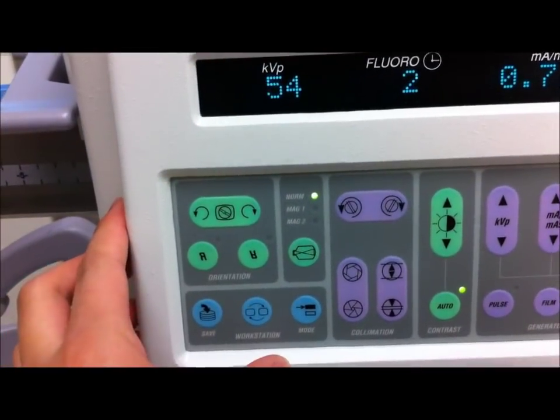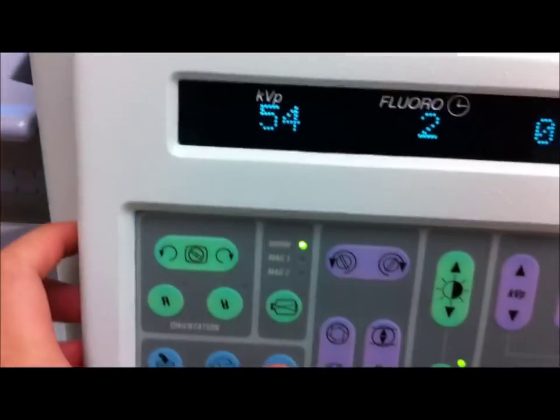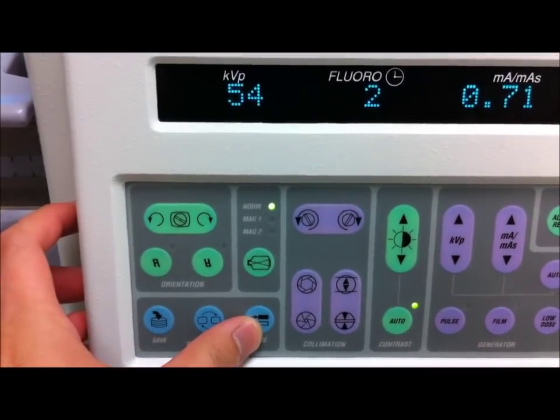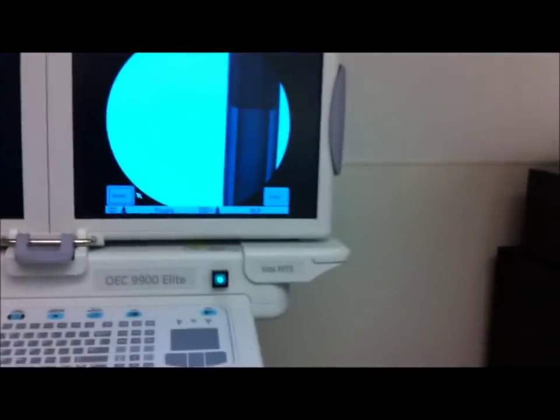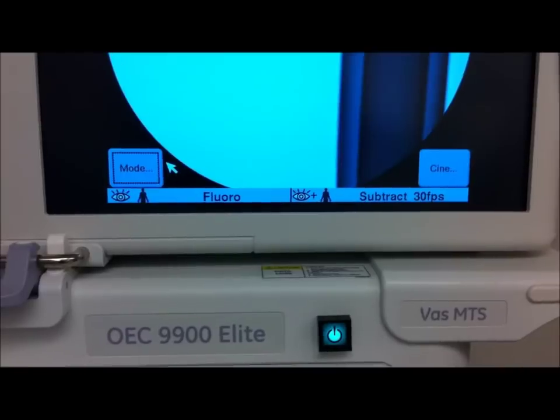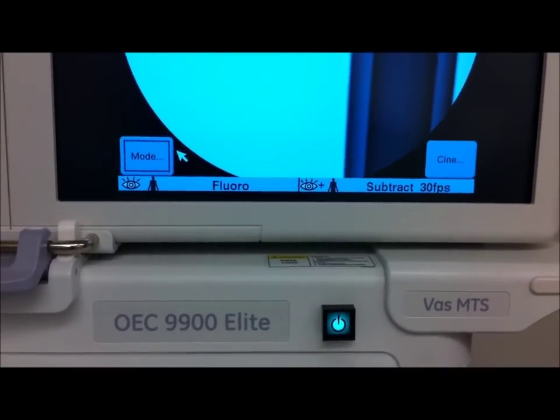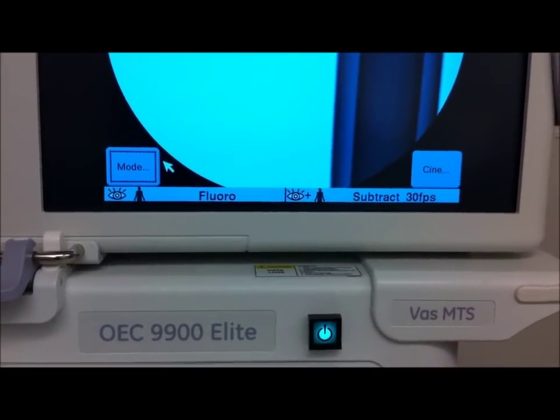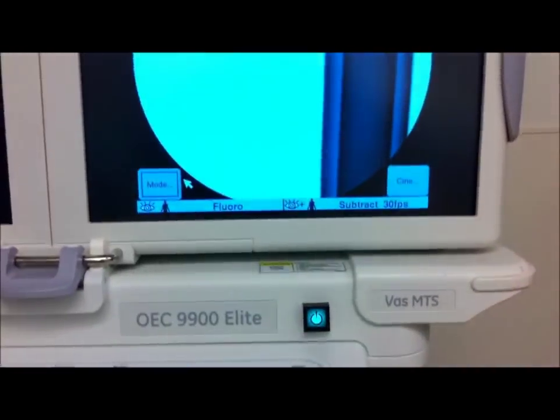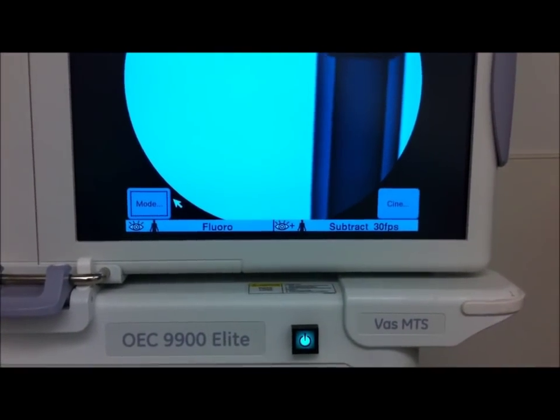This one is called mode. It has a special application because this is an interventional C-arm equipped with an interventional package. If I press this — looking at the bottom here — it puts it into subtraction mode. If I press the high-level fluoro button on the foot pedal or on my hand remote, which I'll show you later, this will put it into digital subtraction mode.